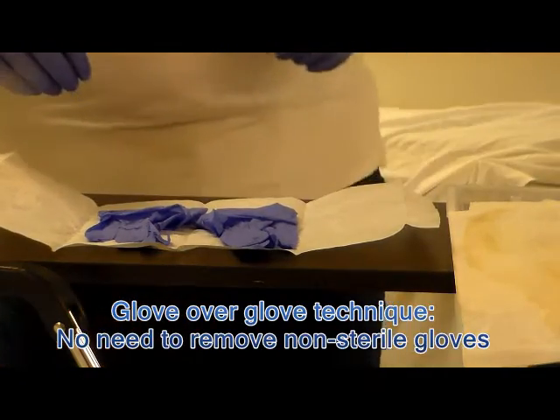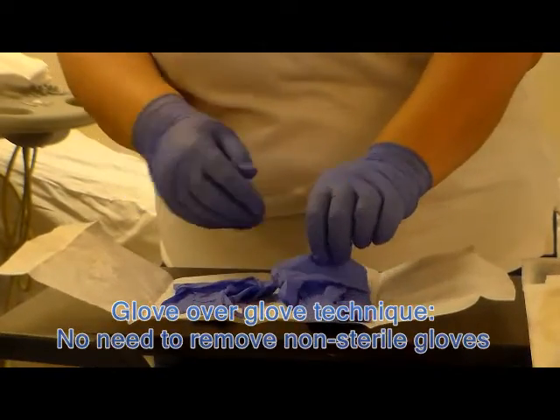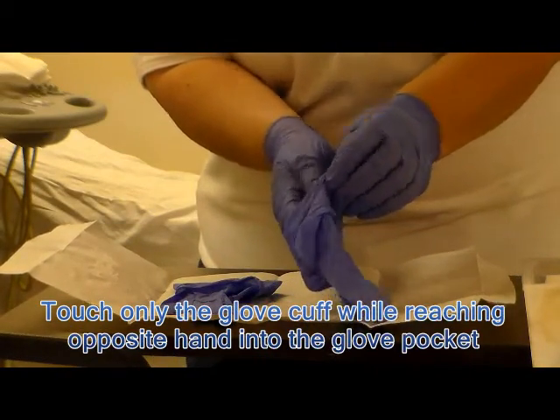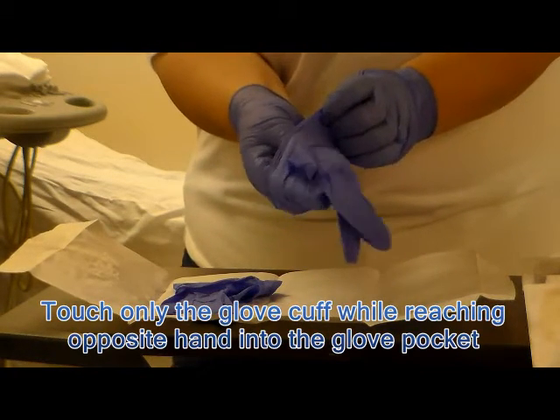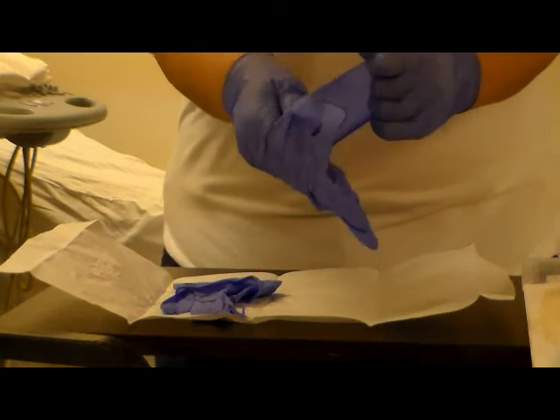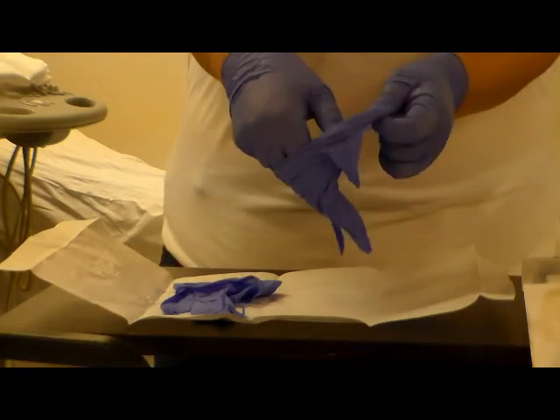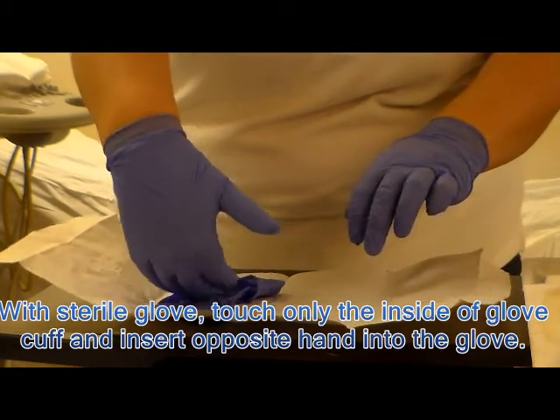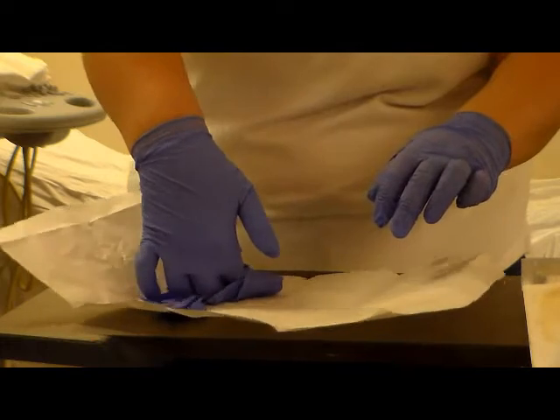In this case what we will be doing is glove over glove. The first glove we're going to hold only the cuff, which because it's folded over is the inside of the glove. Line up your fingers. On the second glove, you're going to go under the cuff using your sterile glove, maintaining its sterility.